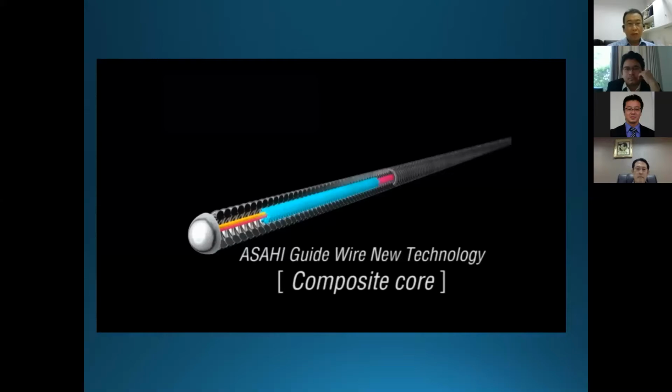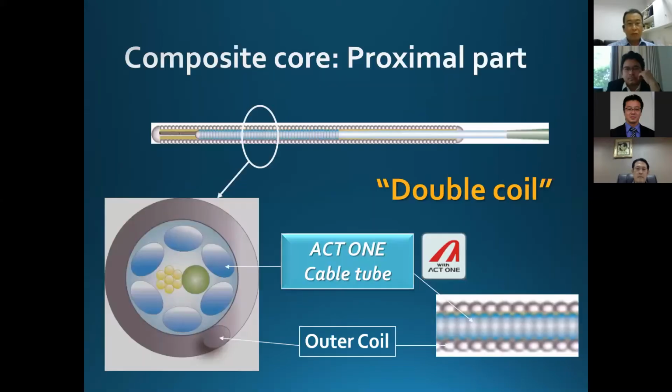I would like to explain more using this picture. Please focus on the proximal part of this Sion guide wire, this part.